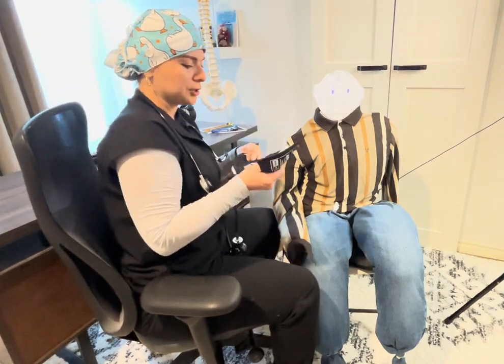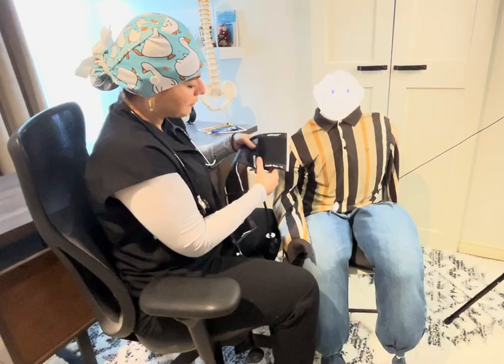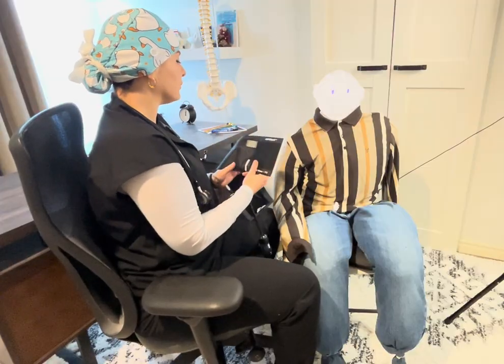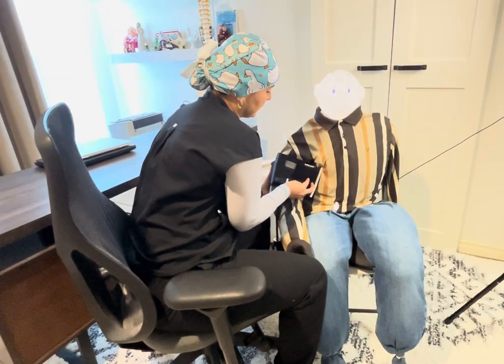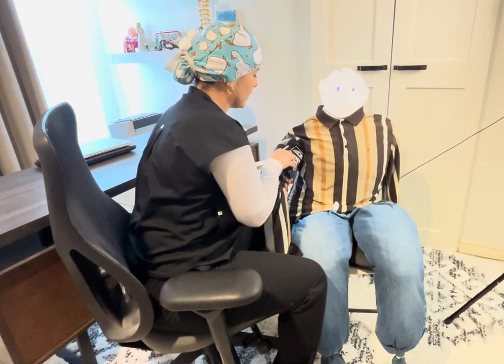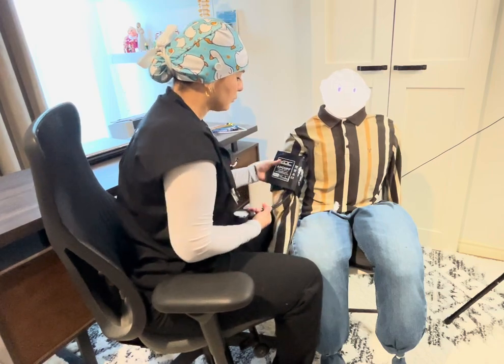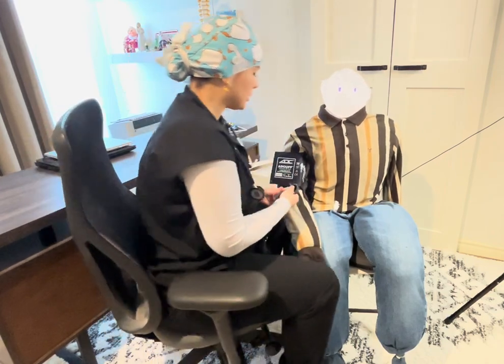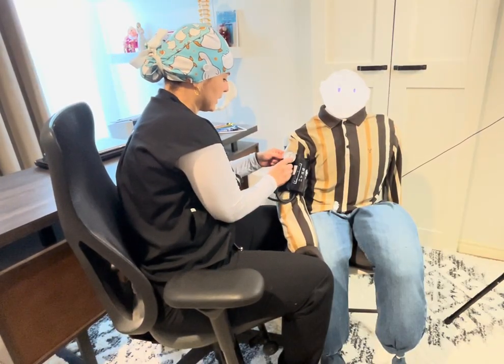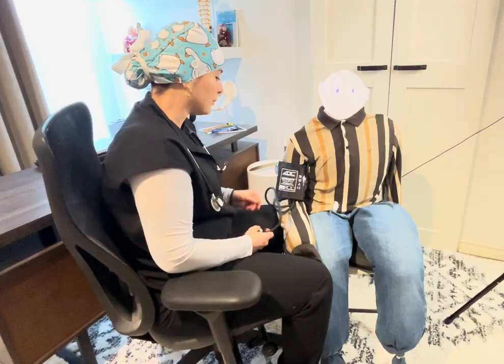Here I have the blood pressure cuff. When applying it, you'll see a sign that says 'artery mark' — this should sit right above the brachial pulse. Go ahead and apply it there. Make sure you are using the accurate and proper cuff size for your patient, because if it's too large or too small the reading won't be accurate. There's a place for the gauge so you can see the numbers while inflating.